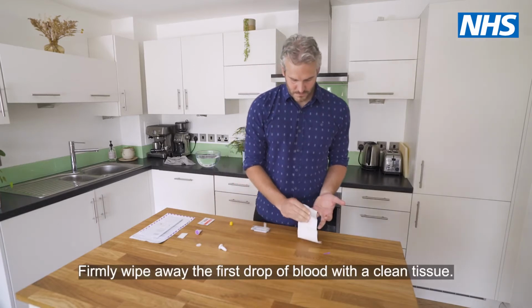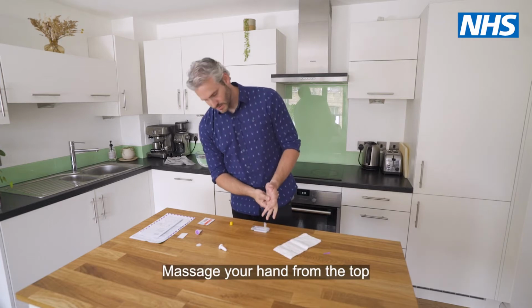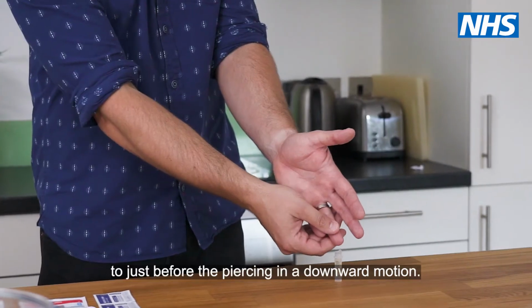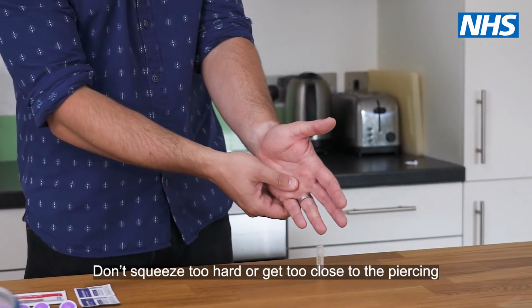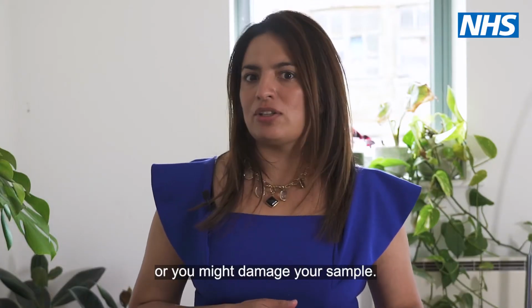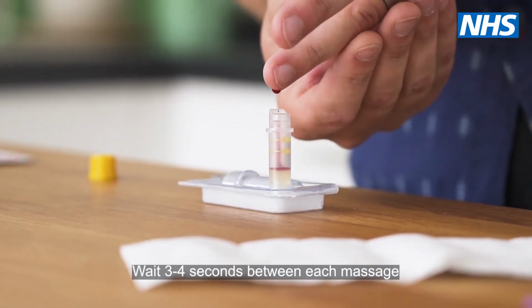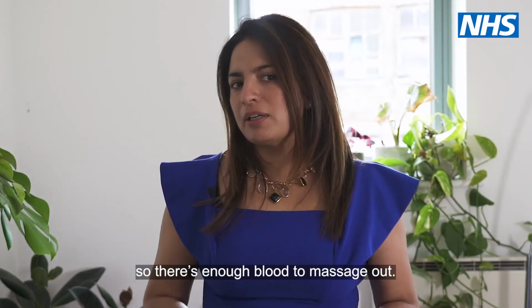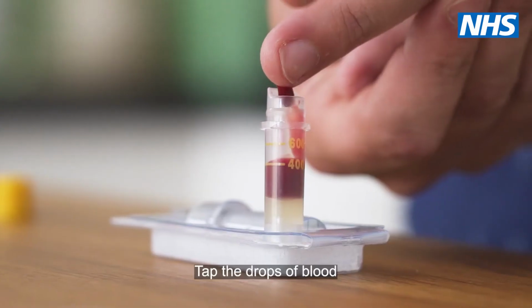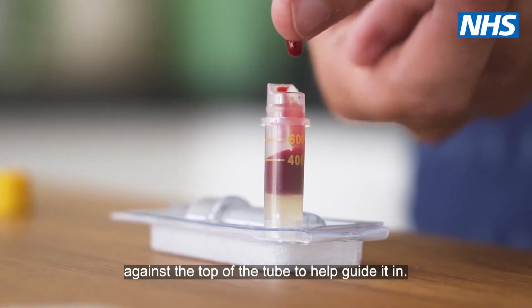Firmly wipe away the first drop of blood with a clean tissue. Massage your hand from the top to just before the piercing in a downward motion. Don't squeeze too hard or get too close to the piercing, or you might damage the sample. Wait 3 to 4 seconds between each massage so there is enough blood to massage out. Tap the drops of blood against the top of the tube to help guide it in.